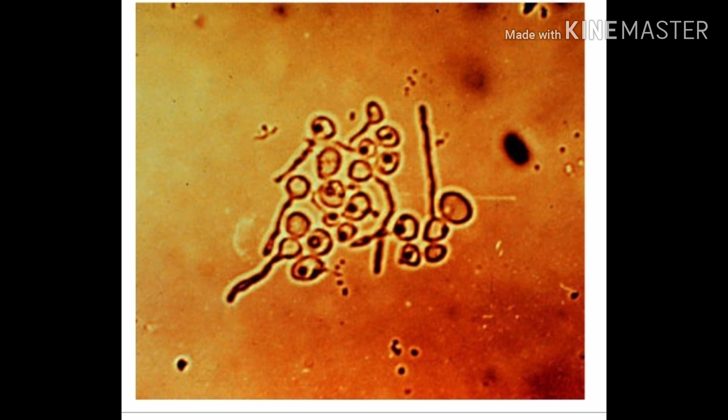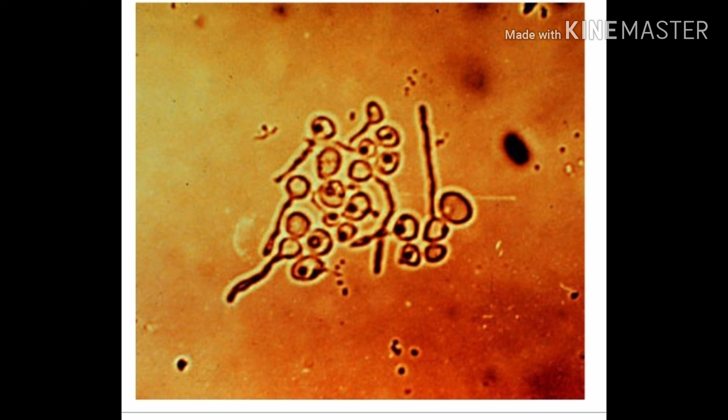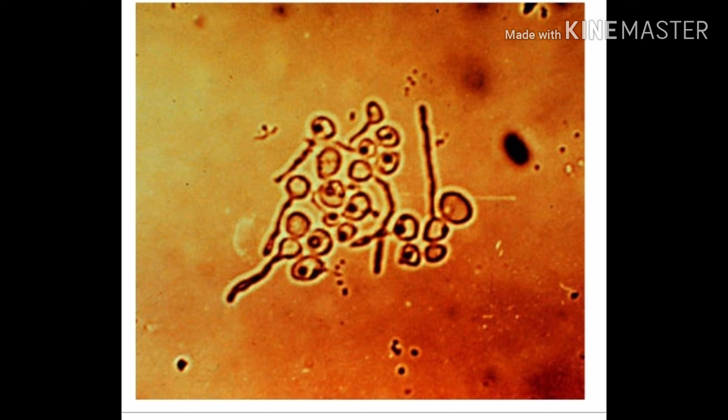This shows the germ tube of Candida, and another slide shows Candida tongue scraping from probably an HIV patient or immunocompromised patient. Three things associated with Candida to remember are OCP use, diabetes mellitus, or antibiotic use, and other than that there will be immunocompromised patients such as HIV patients.